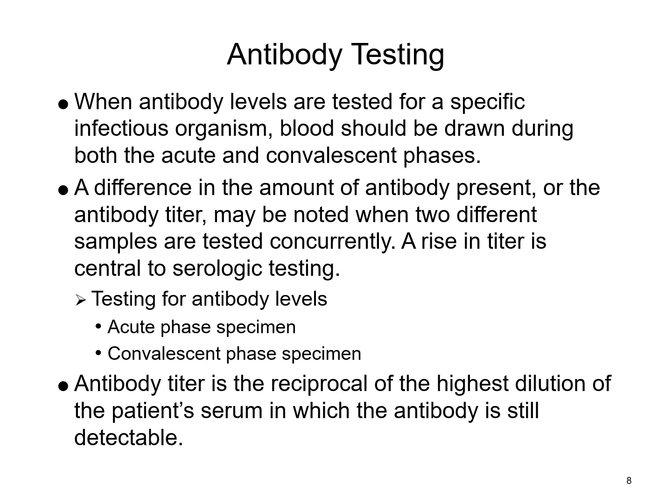So doing an antibody titer and diluting down the concentration of those antibodies that are present helps us put a numerical value, or a semi-quantitative type of value, on the patient as far as the level of where they're at, so that we can continue to monitor those levels.